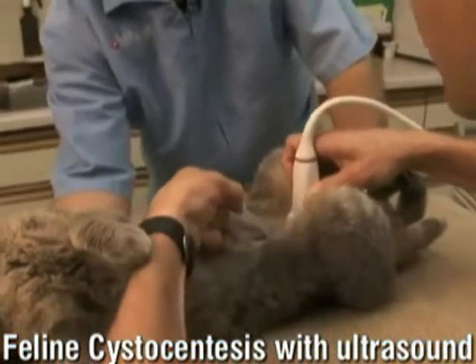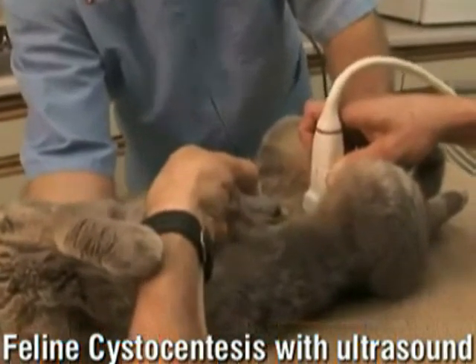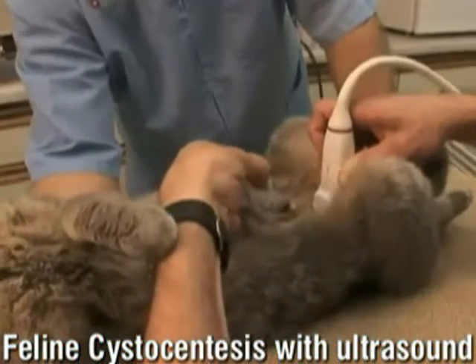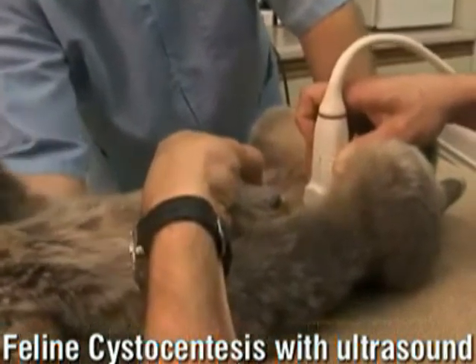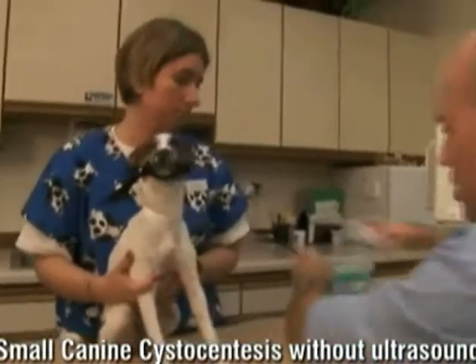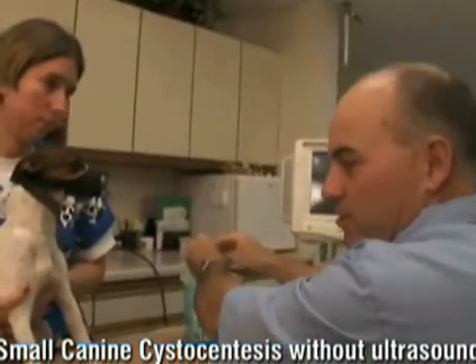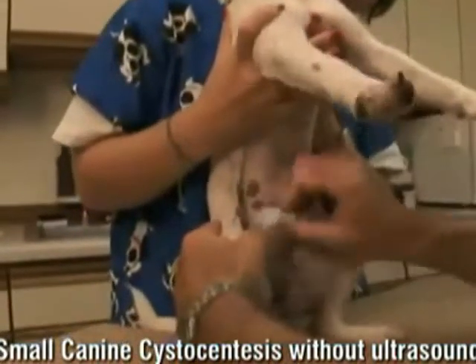Bob, would you point to her bladder right there — that dark area. Once again, you can look for stones and tumors, make sure there are none, which there's none. That's a small bladder, but you can see the needle coming right in. Nice shot, Bob. You're only going to get urine on a cat like this with a bladder that small with ultrasound. That may be about as much as you can get on this one. The animals are usually really good.